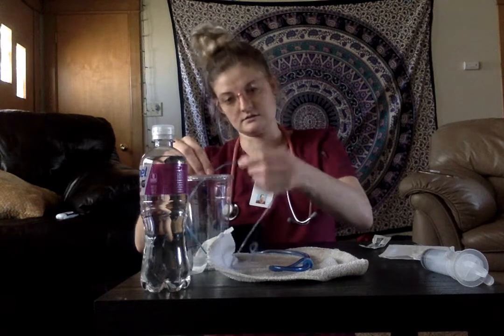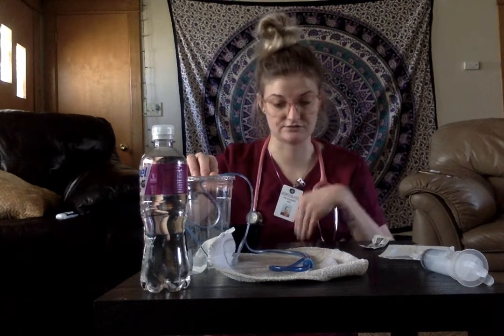place it to the oropharynx, and then give them a breather, tilt their head forward, and give them water to drink as you do this. So then as you're doing the second part, as they swallow, you want to push it down, hand over hand, pressing it down until you get to the location that you taped. And at this time, you also want to check the back of their throat, making sure that it's not coiled and it's not in their mouth and it's actually down their throat.